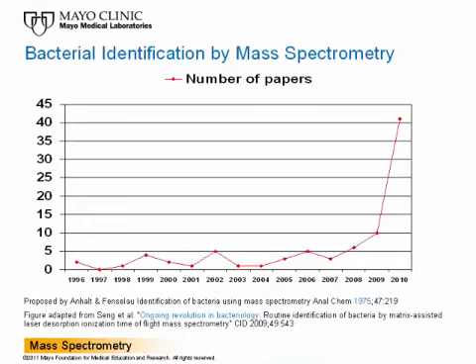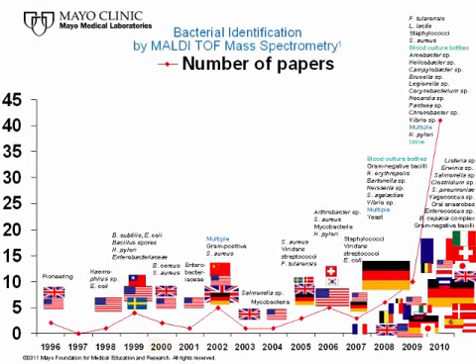The number of publications on microbial identification by matrix-assisted laser desorption ionization time-of-flight mass spectrometry has skyrocketed over the last couple of years because of high identification rates combined with fast turnover time and low costs for consumables compared with conventional methods. This new technology has performed excellently. Some studies have even shown that matrix-assisted laser desorption ionization time-of-flight mass spectrometry outperforms conventional identification assays.